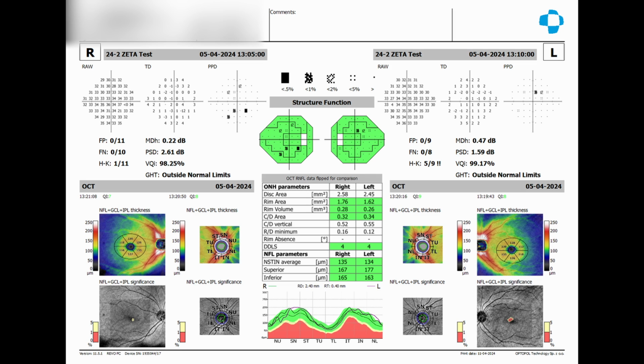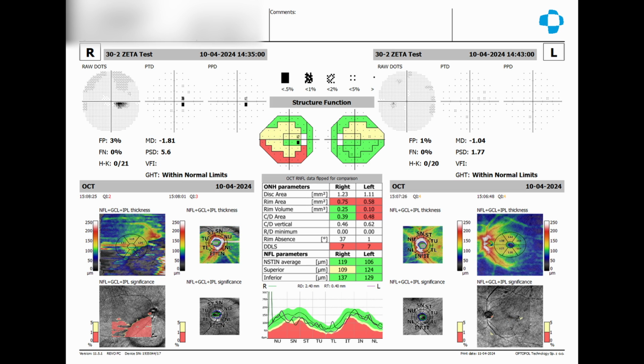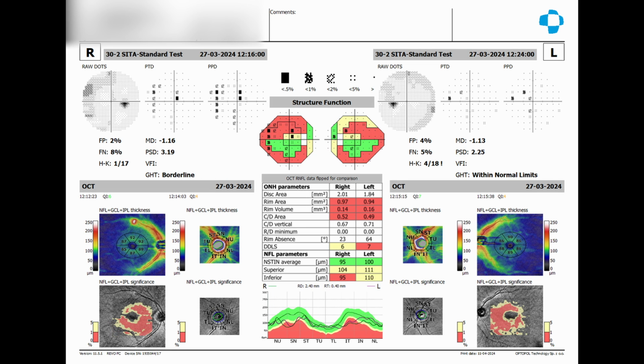This is highly useful. Naturally, there is a competitor called Zeiss Forum with Glaucoma Workspace, where you can combine the OCT with Fundus Photo from Clarus and then the HFA, but it's very expensive. So you have to buy licenses for each program. You have to buy licenses for different computers. Not to mention that Zeiss equipment is way more expensive than the Optopols.